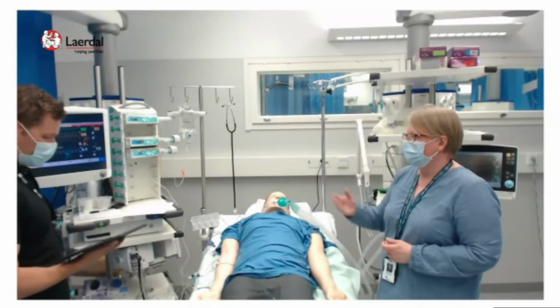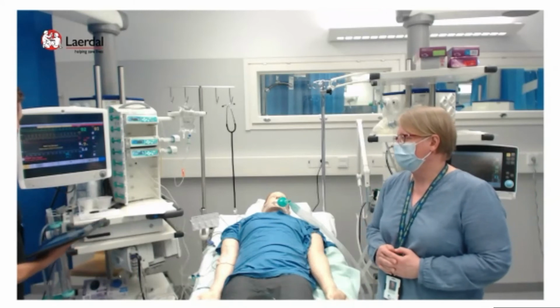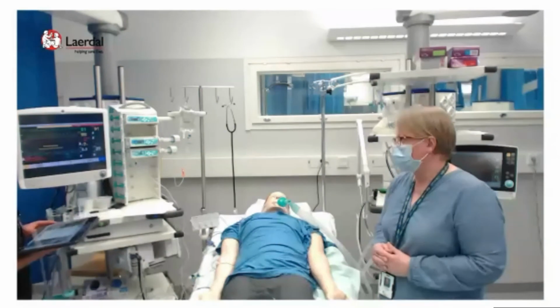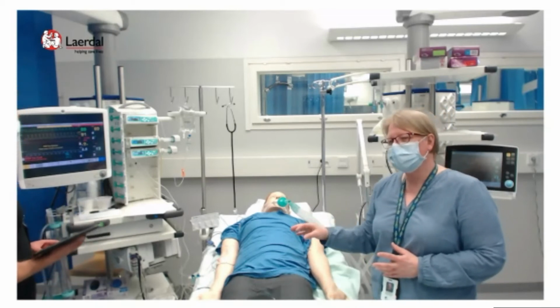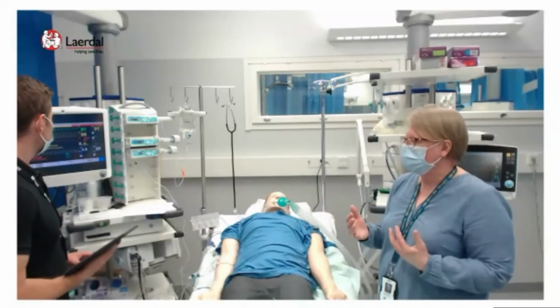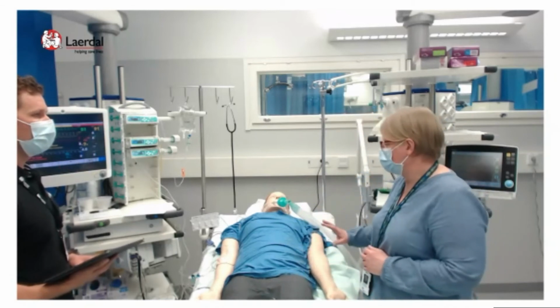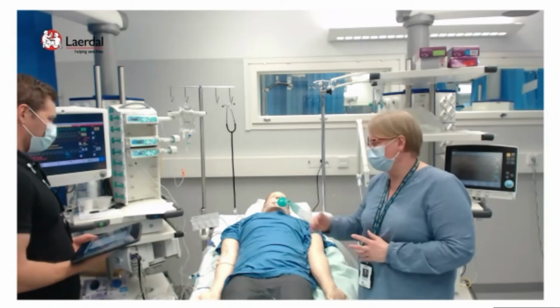Yeah, and after the recommendations that we got from our attendee, we can see a little bit of improvement in the vitals here. The heart rate has decreased to around 90. The saturation is roughly 90 as well. No significant changes in blood pressure, and the capnograph is about the same, 5.2 at the moment. Yeah, I would now take an arterial blood gas sample and check the vitals, how is the oxygenation, how is the pH, what has happened to carbon dioxide, how is the patient faring, and do the airway, breathing, circulation evaluation again to see that this is okay. Then I can go to coffee after the treatment, after this difficult case.